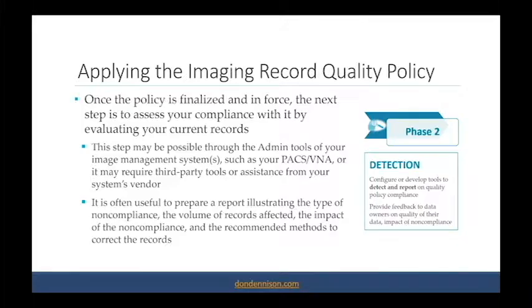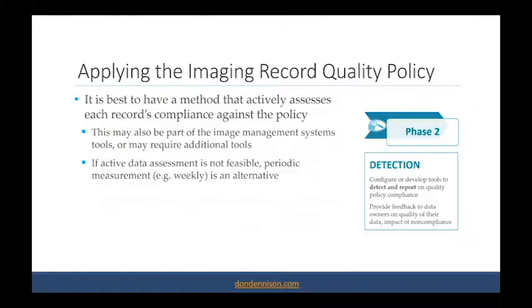Typically, the non-compliant records are coming from the same facility or the same system or same device, and this will be a first pass to identify who the culprits are that you probably need to go and do some corrective action on, on a system or training basis. So as I described, you can do that report. One of the higher level or better approaches is if you can actually put in force a set of tools on your image management systems that will, on a real-time basis, as data is coming in, being stored to it by a modality, or say a PACS into a VNA, actively measure this and report on it.